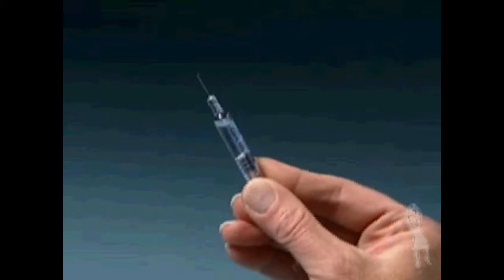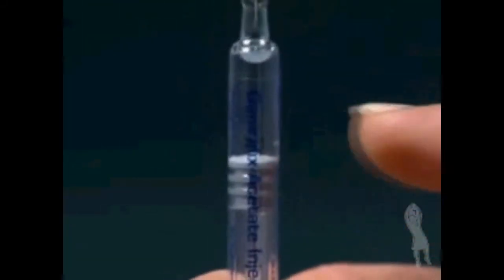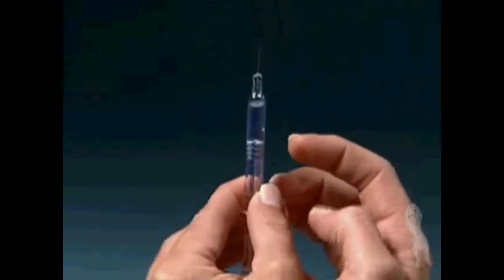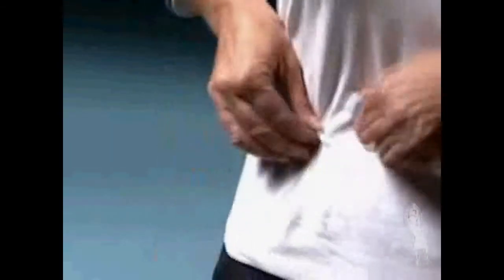Carefully pull or twist off the protective needle cap. To remove any air bubbles in the syringe, point the needle upward and gently tap on the syringe. When all bubbles have risen to the top, slightly press the plunger until a small drop of solution appears at the tip of the needle.